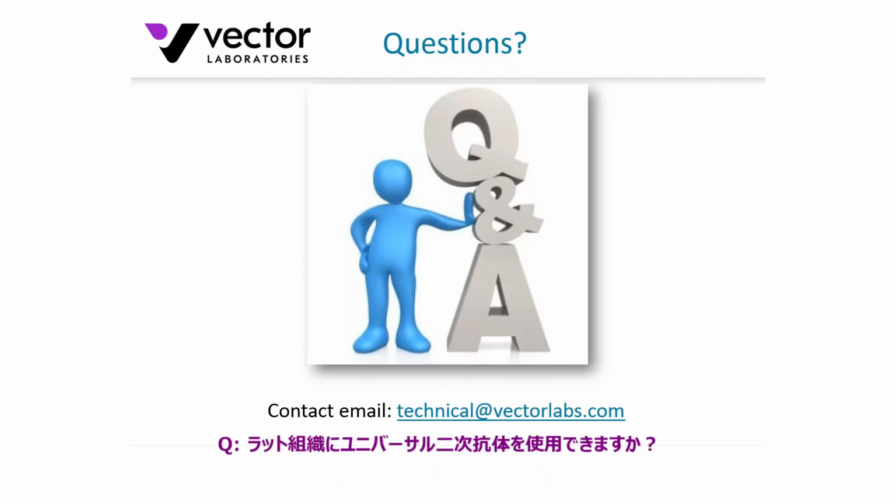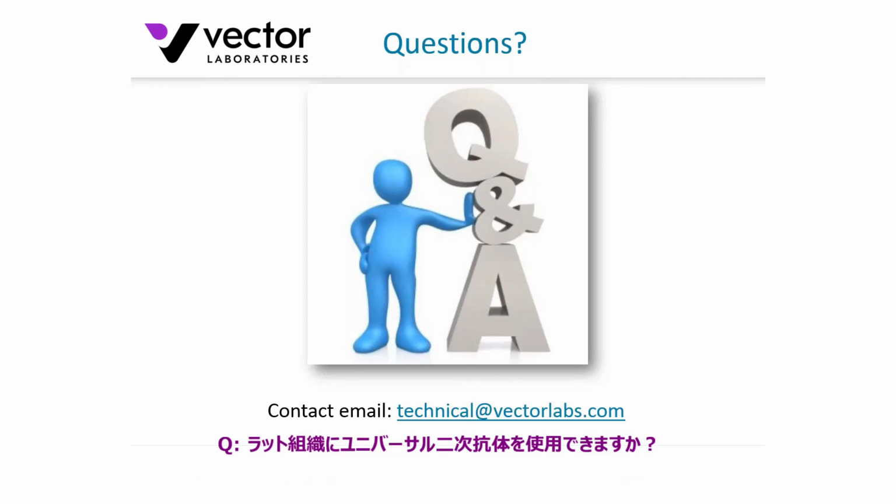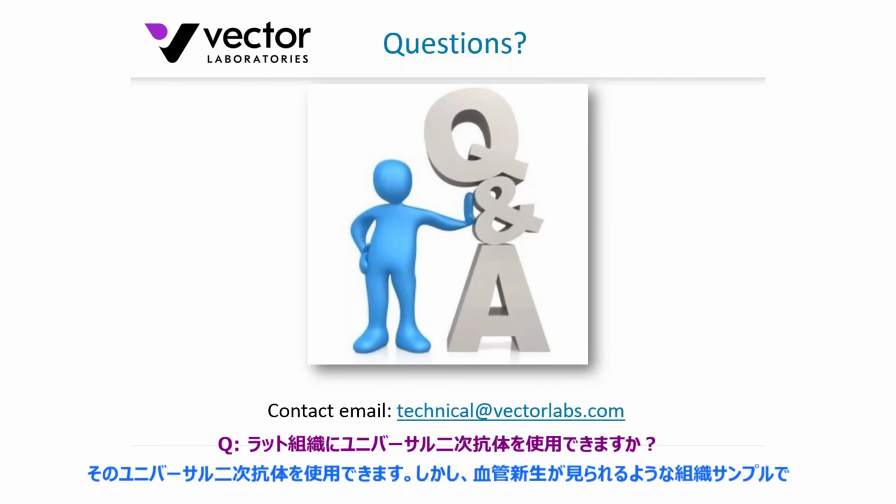The last question is, can I use a universal secondary antibody, for example, anti-mouse and anti-rabbit, on rat tissue? The quick answer is yes, but you want to be a little aware of the fact that the anti-mouse component of that universal antibody would have some percent of cross-reactivity with rat IgG. Now, if the tissue itself doesn't exhibit any detectable IgG, then there wouldn't be a concern in applying that. Maybe the tissue is a cell monolayer, or maybe a perfused fixed specimen that's washed out almost all of the IgG, then you can apply that mouse rabbit secondary antibody.